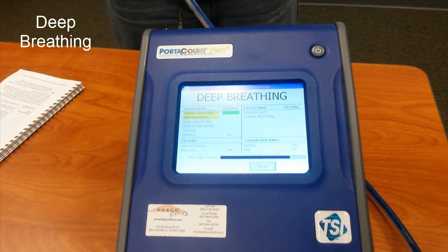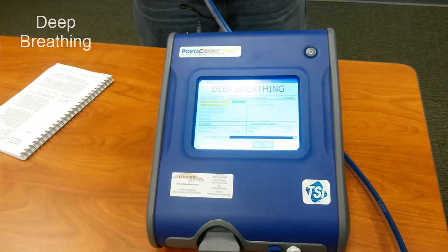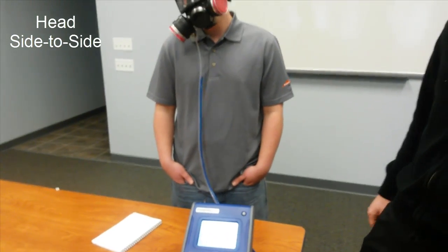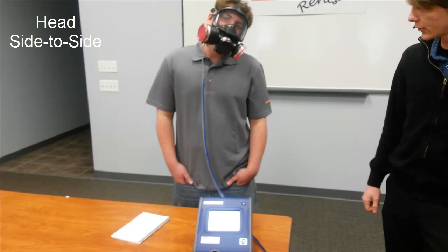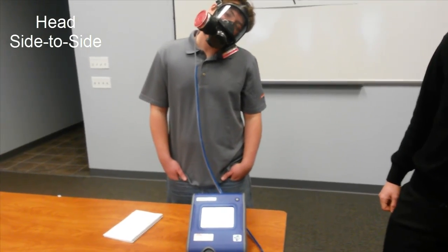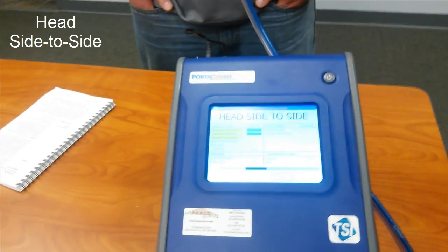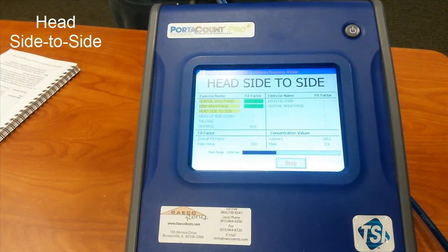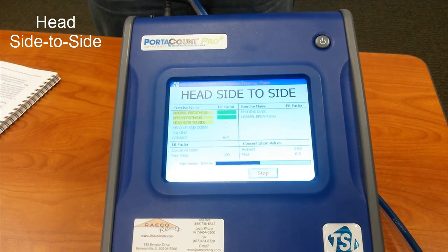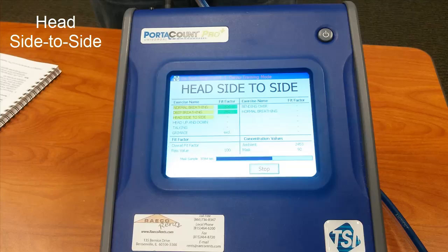Once the deep breathing portion finishes up, we're going to move on to the head side to side exercise. Nolan is going to tilt his head from the left to the right, trying to touch his ear to his shoulder and pausing for a second at each point on the side. The reason for the movements is to make sure that when you're using a mask and you're working, you're able to move around without it leaking. Through this portion he's just going to breathe normally, comfortably, staying relaxed.